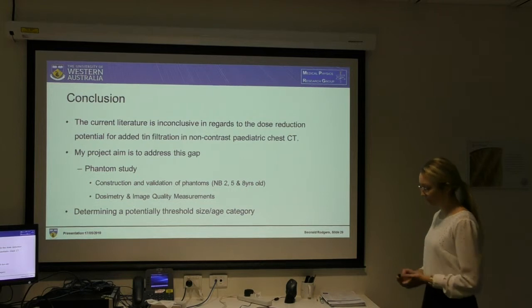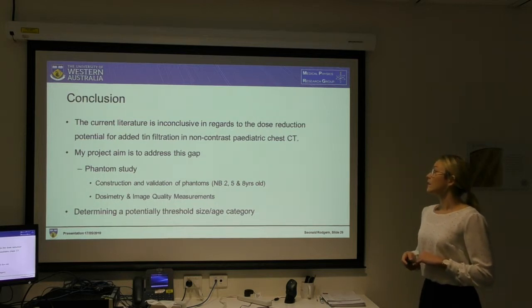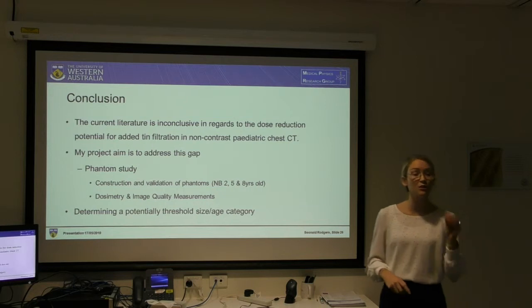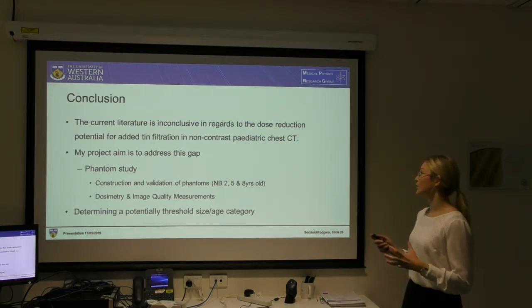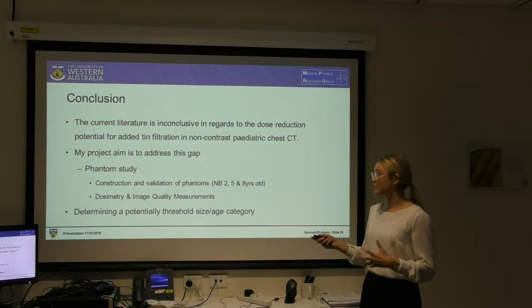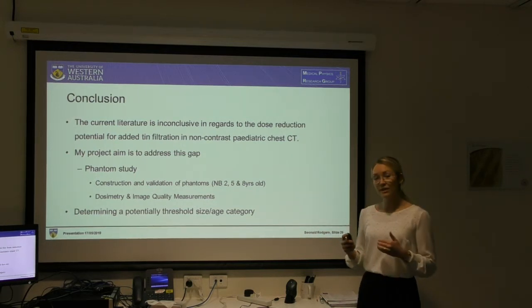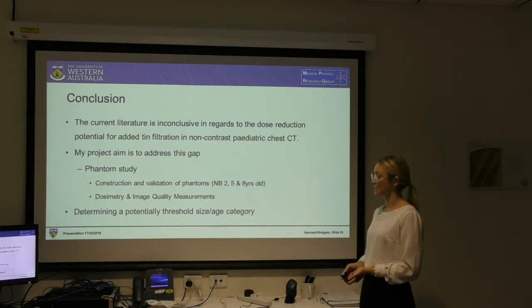In conclusion, the current literature is inconclusive in regards to the dose reduction potential of using added tin filtration on non-contrast paediatric chest CT, and my project aims to address this gap in the literature. It will be a phantom study that involves the construction and validation of various size phantoms with a specific focus on small patient sizes.